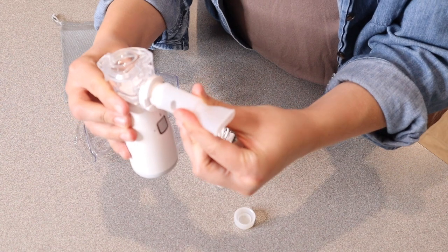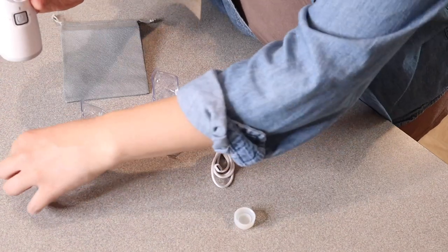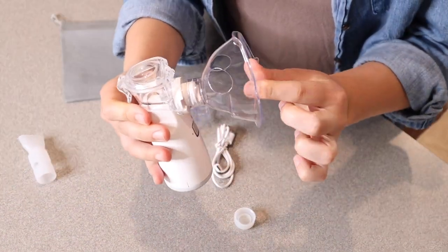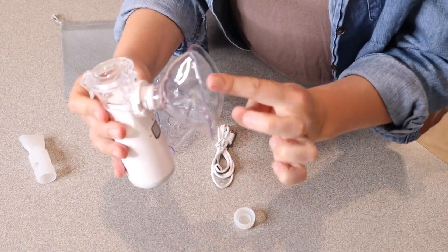You can place this piece on here and that's just going to make it so you breathe this in through your mouth. Or you can put this piece on right here — this is going to be a child size, your standard nebulizer where it goes over your nose and your mouth.